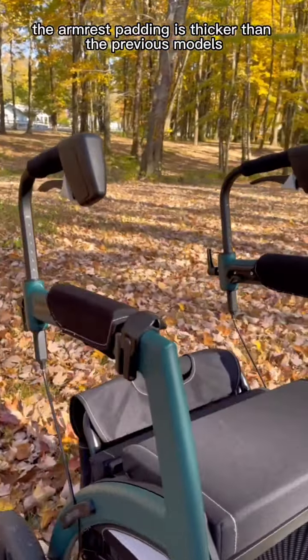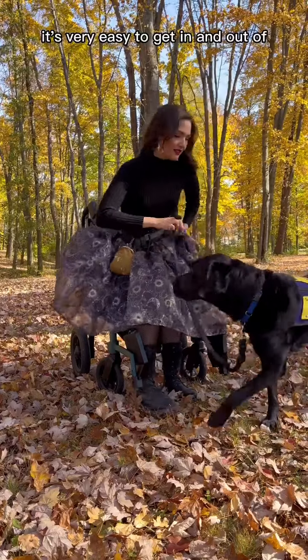The armrest padding is thicker than the previous models, which I really appreciate, and the seat is thicker as well. The air tire feature is amazing — it makes it much lighter and much less bumpy, whether you're using it as a rollator or as a wheelchair.